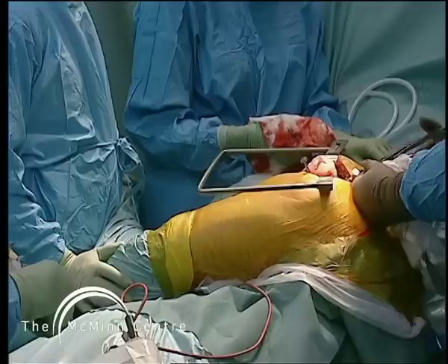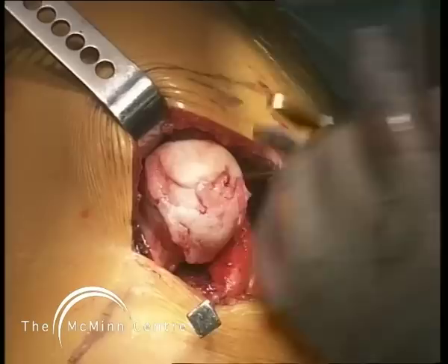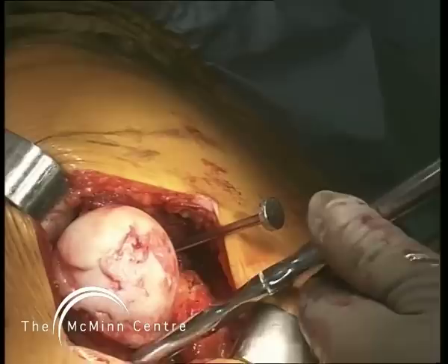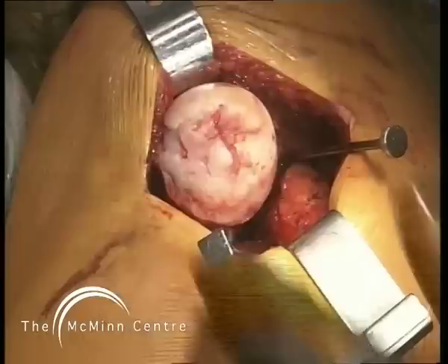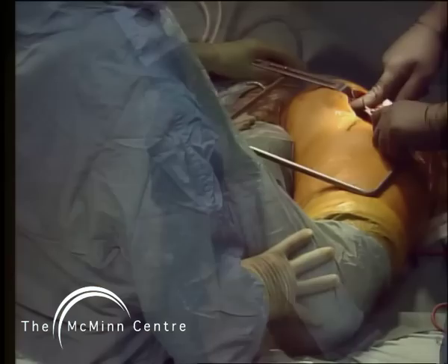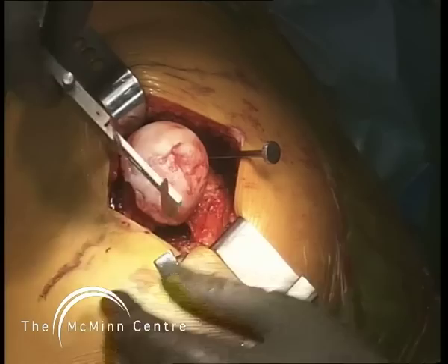If you have an assistant who acts like a statue this makes life very difficult with a minimum exposure. He keeps moving the femoral head around so that I can work on the femoral head and neck. It's important to remove all osteophyte at this stage because you want to know where the neck is rather than neck plus osteophyte. For our own records we record the maximum neck diameter, the minimum neck diameter, the maximum head diameter, and the minimum head diameter in all patients.